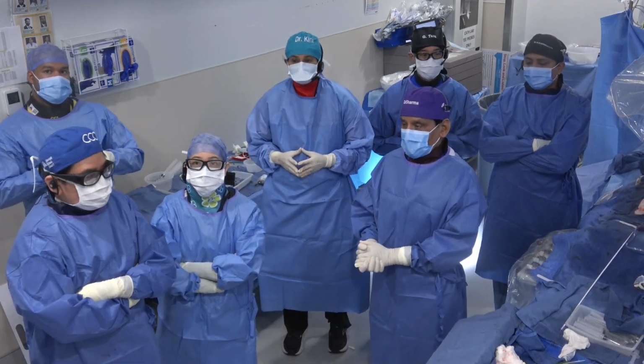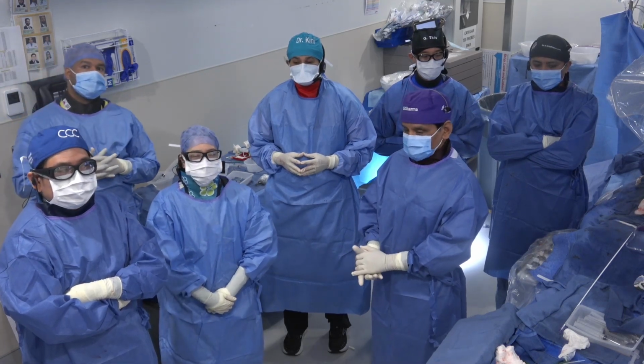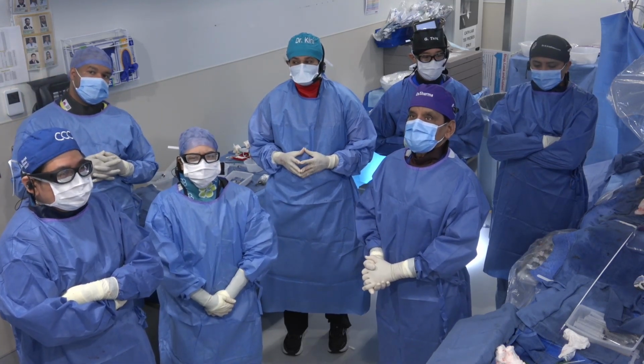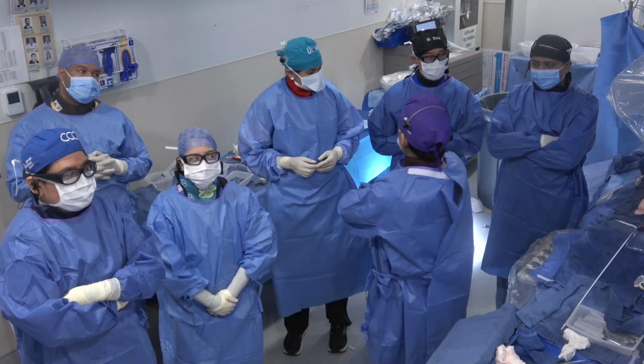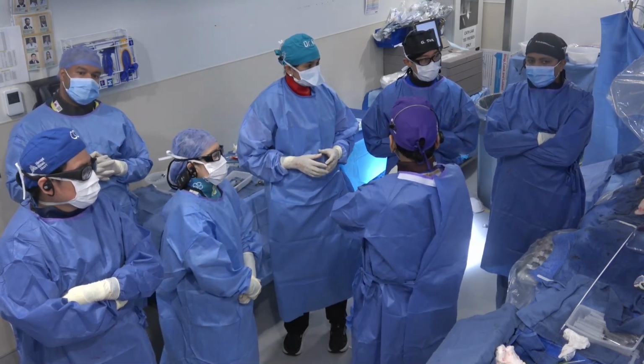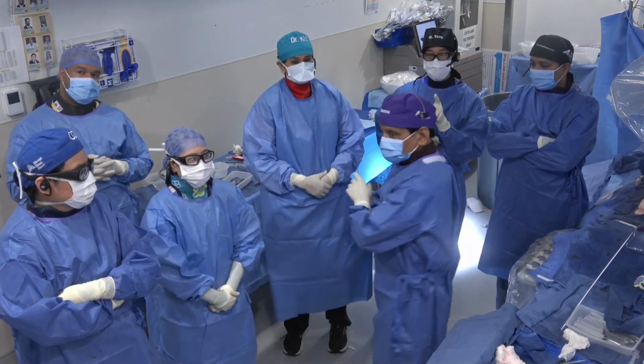Again here. Yeah. Just one small question to you and Dr. Tang. In a valve-in-valve case, the shortening may not happen from the lower end because the interaction may be different. So can you give some highlight on that? Good question. But in TAV in SAV, like today's case, there's not that much. It's mostly from the bottom. But TAV in TAV, absolutely.